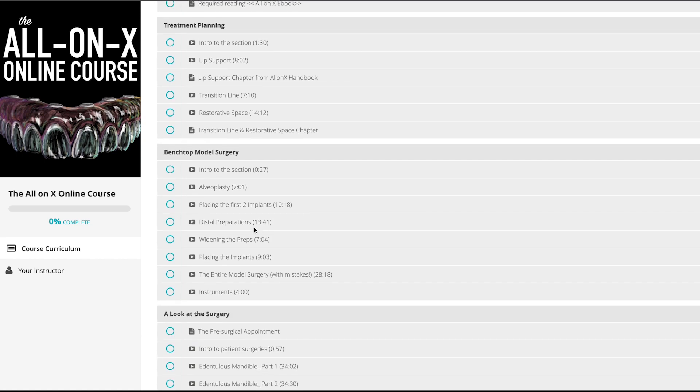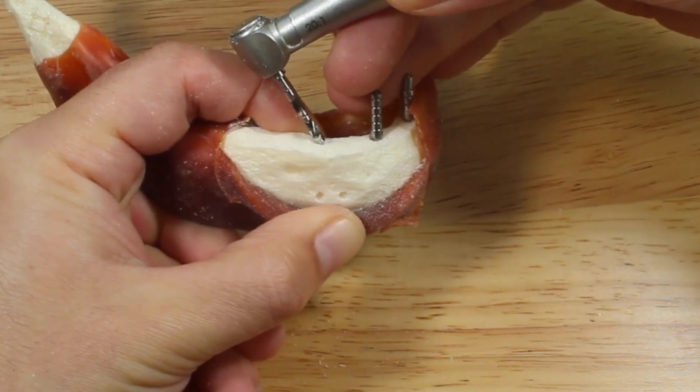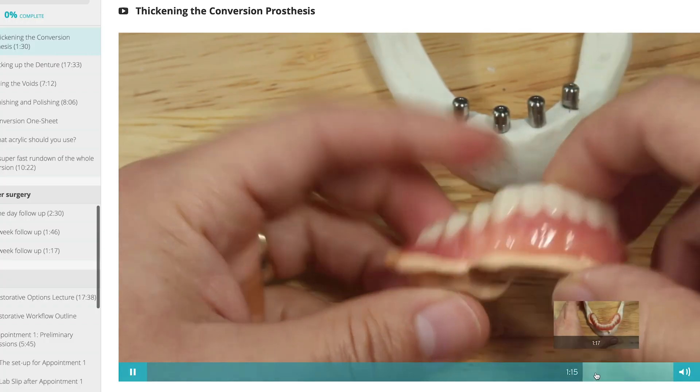We're going to start out by taking a look at a step-by-step surgical demonstration on a benchtop model. We're going to cover preparation of the sites, placement of the multi-unit abutments, conversion tips, then we're going to move on to looking at some real patient surgeries in the mouth.